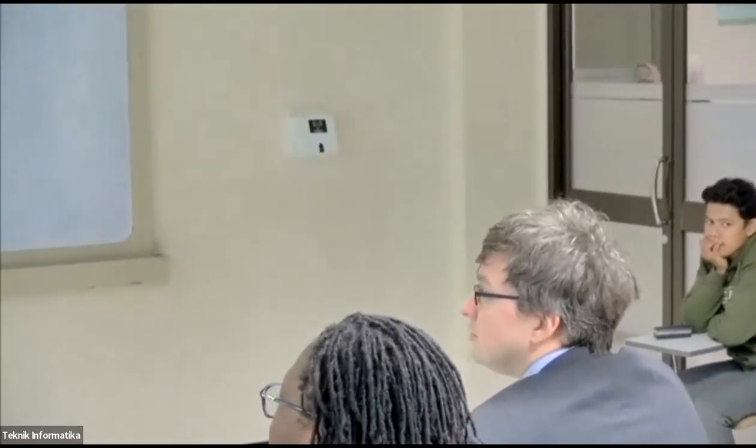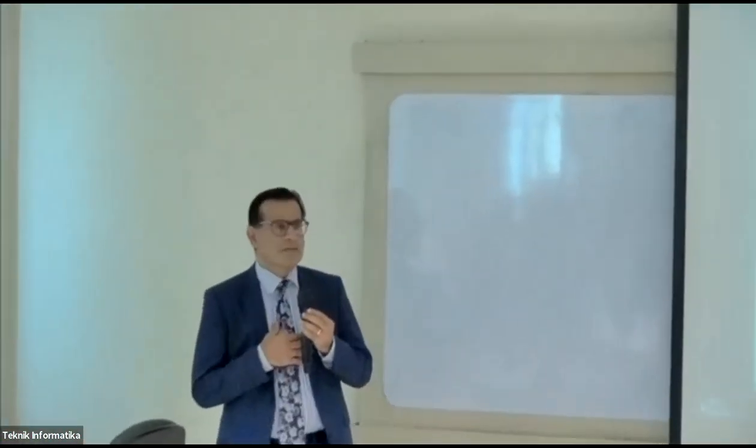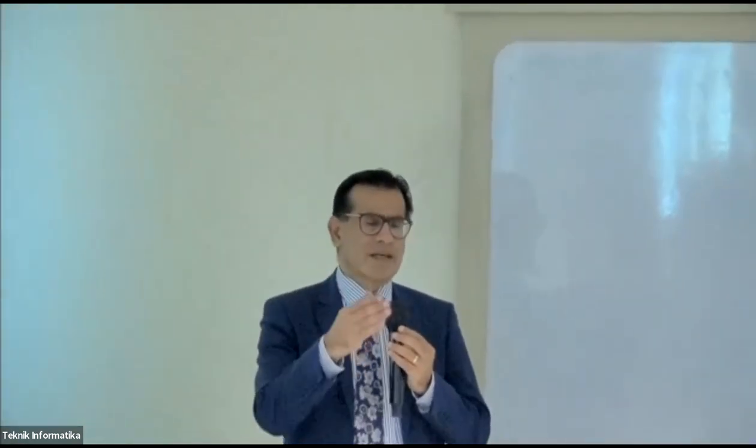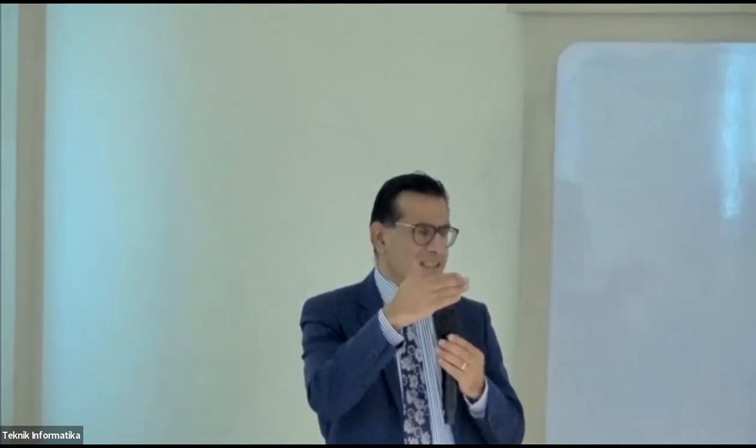I think it all depends on what you're using your AI algorithm for, and it'll depend on the discussion between the patient and the oncologist. But for me personally, let's say it's 90% with confidence intervals of 95 to 85. Then still, the upper limit of confidence is 95%. Still a 1 in 20 chance it's got it wrong, and you're going to decide on getting a horrible chemotherapy on the possibility that it might just be wrong. So I would say no, do the genetic analysis.